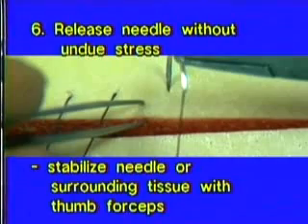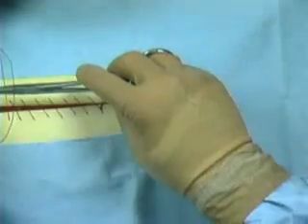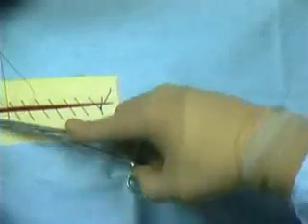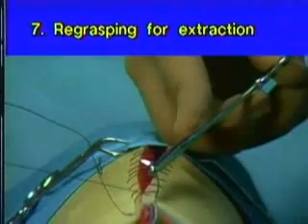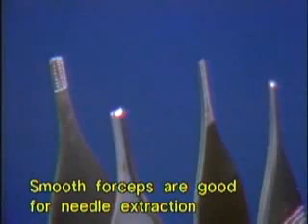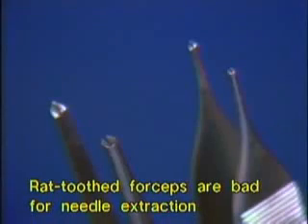Six — release of the needle is for most students the most difficult step in placing a stitch. Releasing the needle without undue stress on tissue is considered by seasoned surgeons as the most critical step. To achieve this, tissue forceps can be used to grasp the point of the needle to prevent it from retracting into the tissue, or the needle can be stabilized by holding the surrounding tissue with the thumb forceps. Perhaps the most important practice for smooth needle release is practicing releasing the lock on the needle holders smoothly. Step seven is re-grasping the needle for extraction. You should try to grasp the needle again perpendicular to the holder to ease extraction with a rotating motion. Smooth thumb forceps or Brown-Adsons help better with needle extraction than a rat tooth forcep like the Adson.